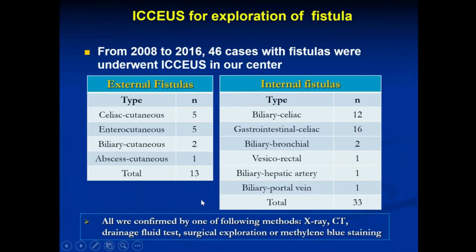So we had performed such studies from 2008 to 2016. 46 cases with fistulas, including external and internal fistulas, underwent ICCEUS in our hospital.